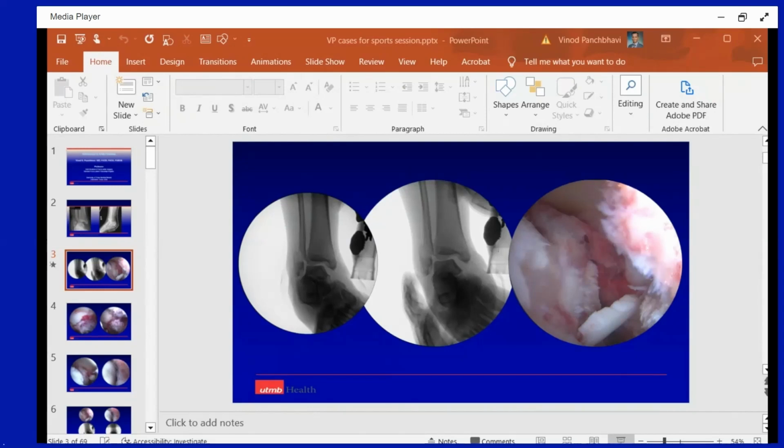And this is another example with the scope. You can see the wide, big gap on the medial side. That means that the deltoid ligament has gone. You don't even have to do anything else to know that. So again, you put in suture anchors. These are arthroscopic pictures, post-deltoid repair. I'm stressing it, and it doesn't open up. I put in everything else, with flexible fixation over here.